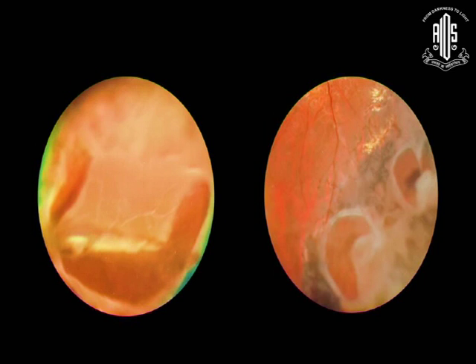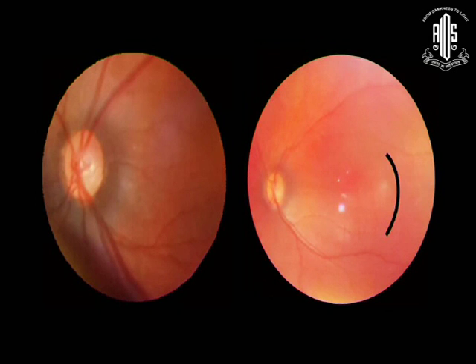And peripheral lesions again, horseshoe tears. You can see the vitreous attachment to the anterior flap. Some pigmented areas are also seen. The other horseshoe tears again.